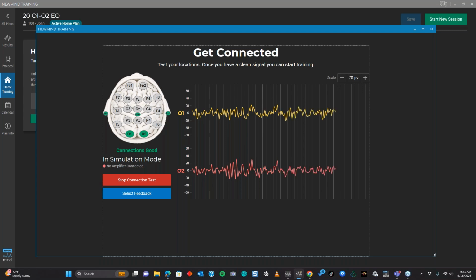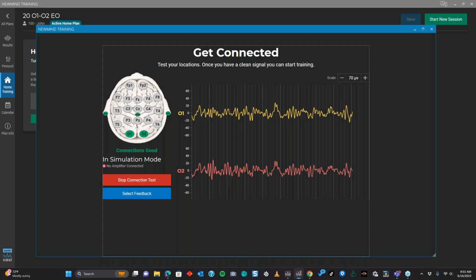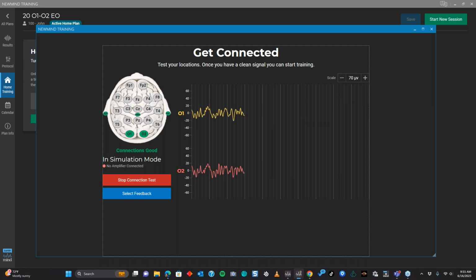I actually had a client at the end of my day yesterday come into our chat. There was a new home trainer, and just the way the conversation went, they were obviously a little nervous and worried about what am I supposed to see? How do I know I've got a good connection? That particular clinic, I don't know who the clinic was, I didn't ask.